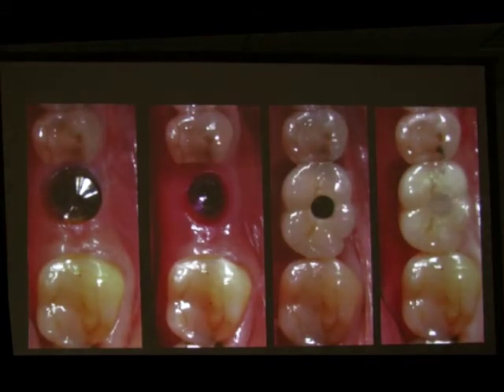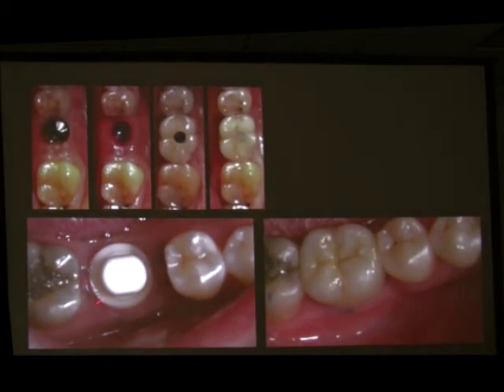When patients come into our office and we explain to them, this is conventional and this is one-piece zirconia. If you do this and you are lucky, meaning a normal population, this crown will not ever move. But if the mechanics and the tolerances of the implants are not perfect, you will have to come every now and then to screw the crown. And I'm sorry, but when we unscrew this, you will have to take some disinfectant because you will smell a strong smell, always.